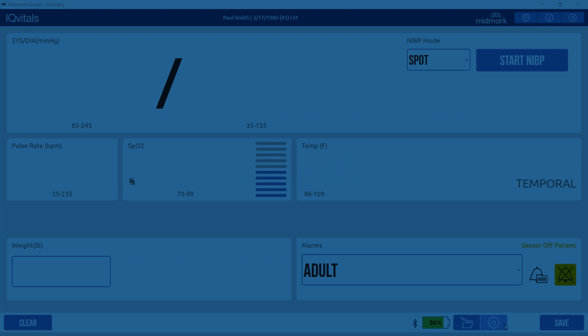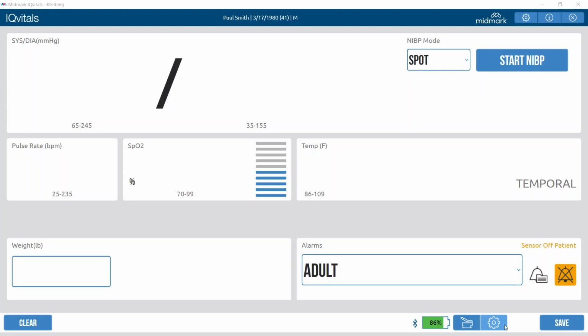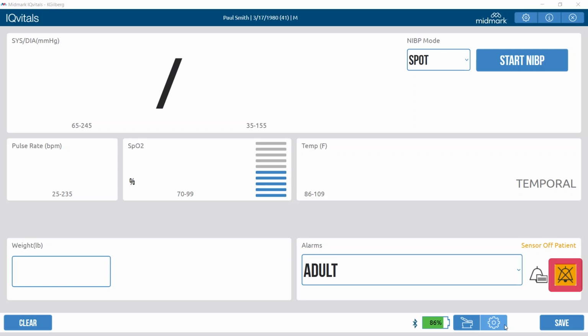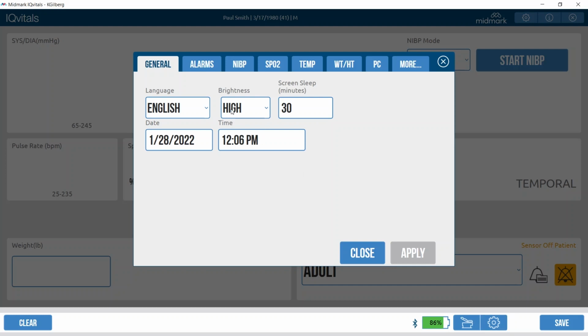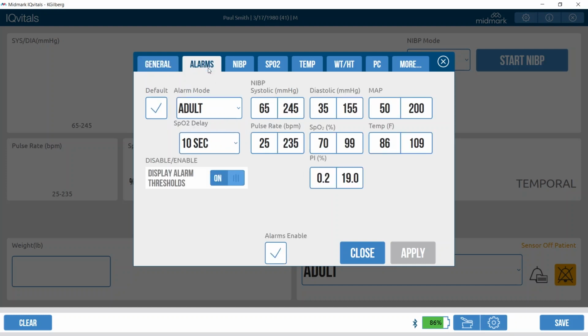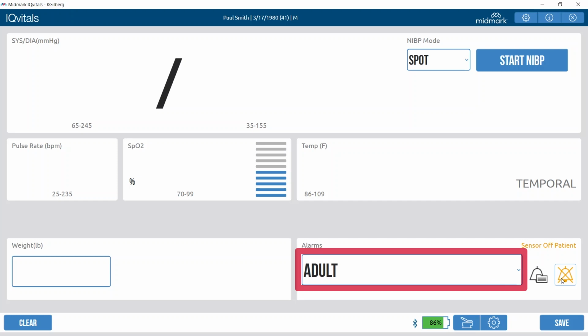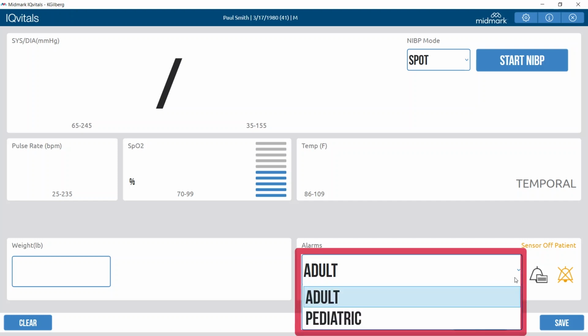Alarms. The Alarms box on the main screen contains the Alarms mode drop-down menu, the Alarm List button, and the Alarm Reset button. Press the Settings button and select the Alarms tab at any point except during cuff inflation and deflation to edit the alarm thresholds. The Alarm Reset button is only available when an audible alarm is sounding. Use the Alarms mode drop-down to change the alarm thresholds between adult settings and pediatric settings.